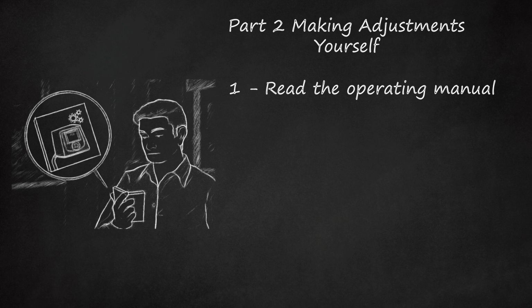There are two main types of constant pressure CPAP machines, data recording and non-data recording, and the methods used to adjust the pressure settings depend upon which type you have. A data recording machine usually stores patient data that is viewable on the machine or from a removable smart card or other memory card on your computer. A data recording machine records several variables that help determine optimum air pressure, including your apnea-hypopnea index, or AHI.